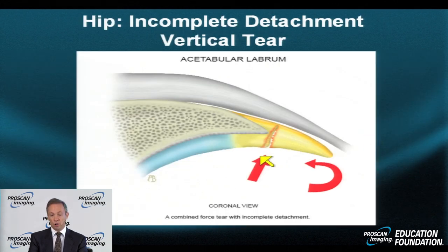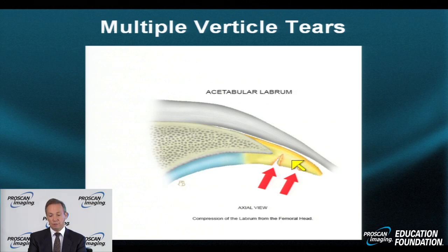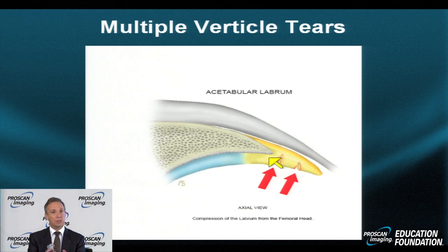Here's an example of a simple vertical tear — these can be partial thickness or full thickness. Now imagine multiple vertical tears: if tears oriented vertically are imaged with a paraaxial plane, they will have a much different configuration. Imaged sagittally, if the sagittal slice doesn't go exactly through the tear you won't see it, but when it does you'll see a defect. The appearance of these tears is dramatically different in each plane, with the coronal plane being the most favored for labral evaluation of the hip.